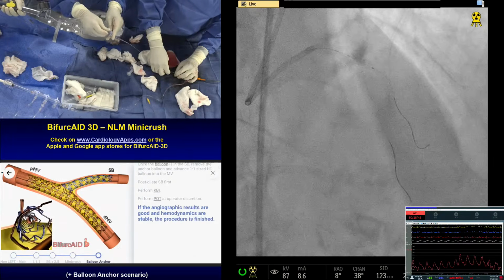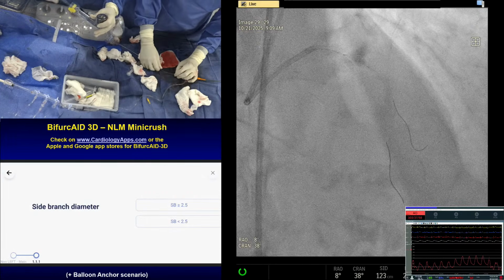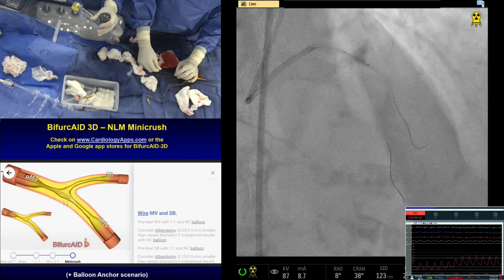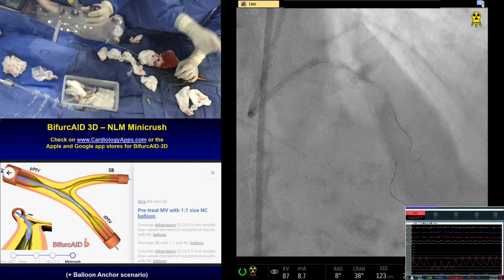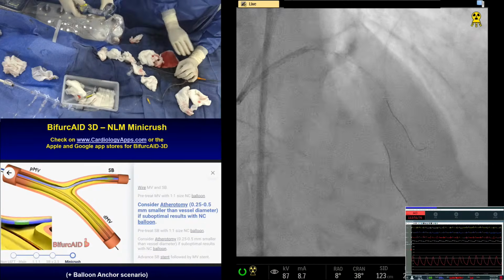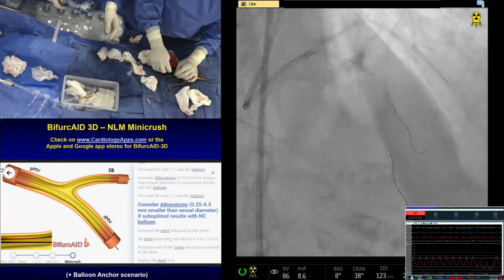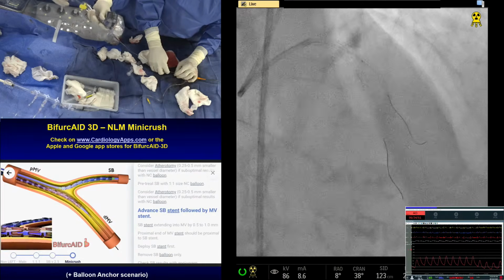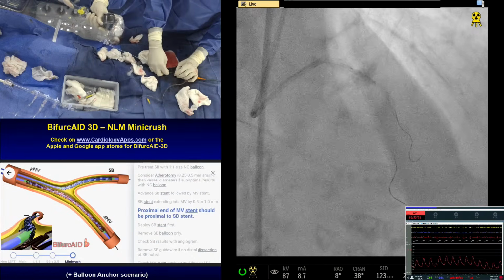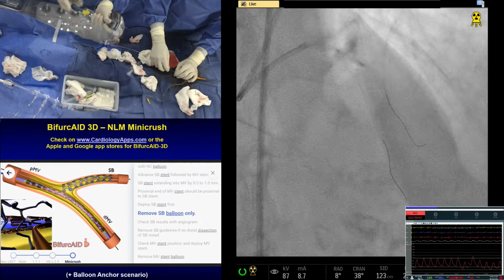Good. Okay, go high. Really open it. I would have gone 2.5 because we had an area of the 2.5. We had 2.5, 12, earlier one. Now it's 2.75, we are 2.75, 12 now. I do not want 2.75. I think we go 2.5 high pressure to open that diag. Not 2.75, I think it's too big.